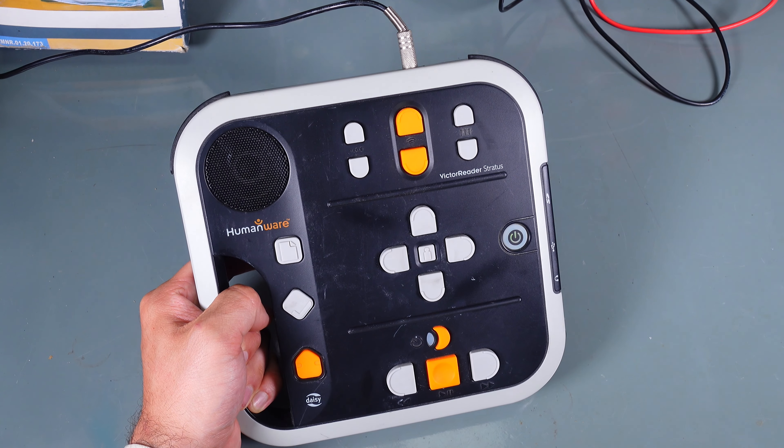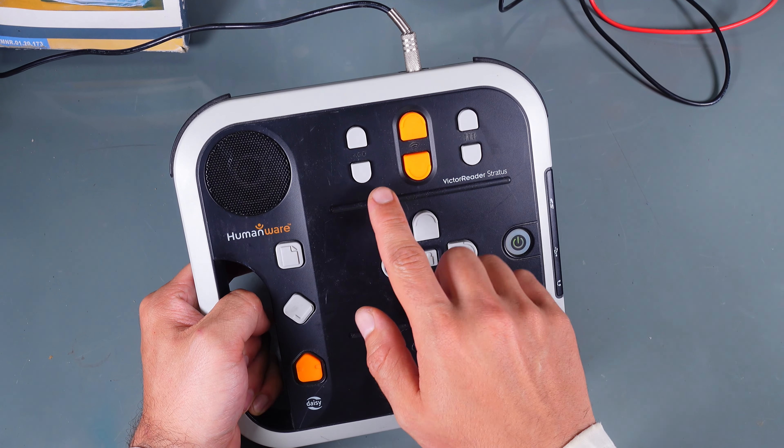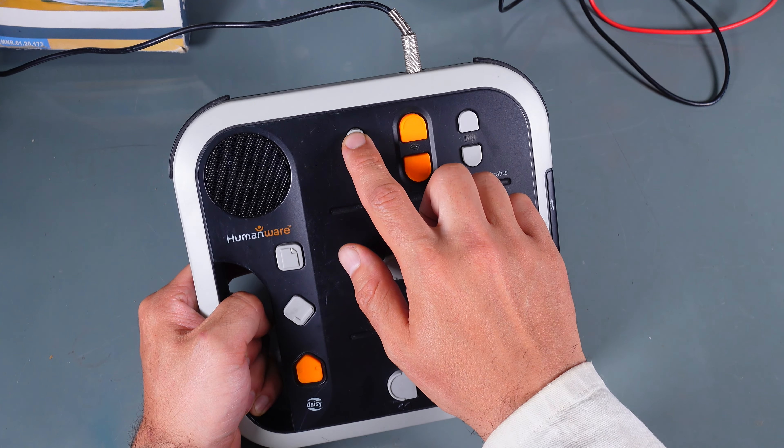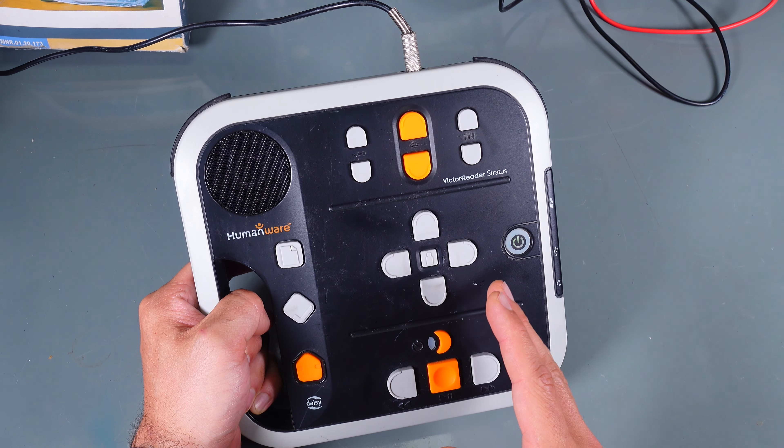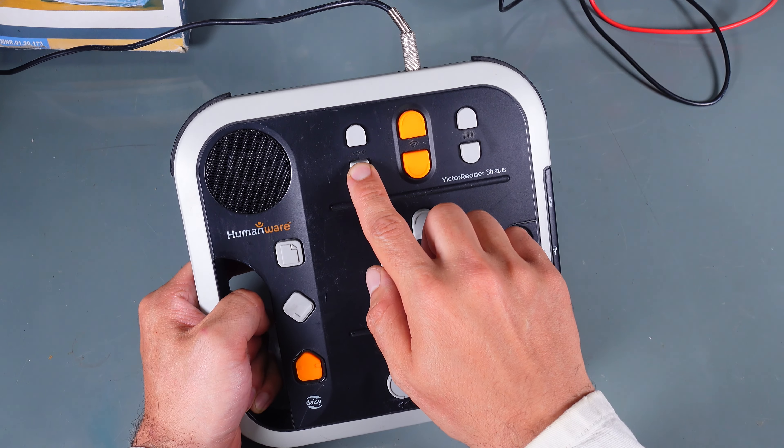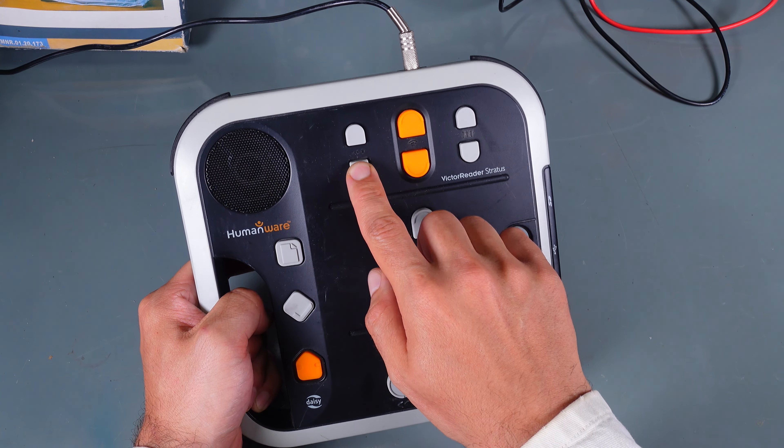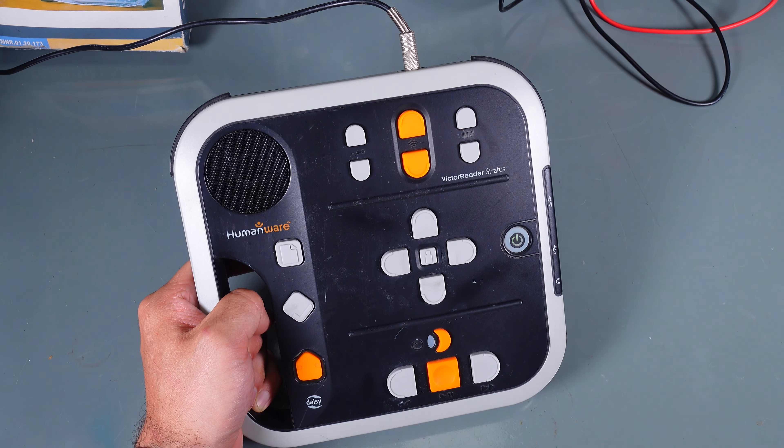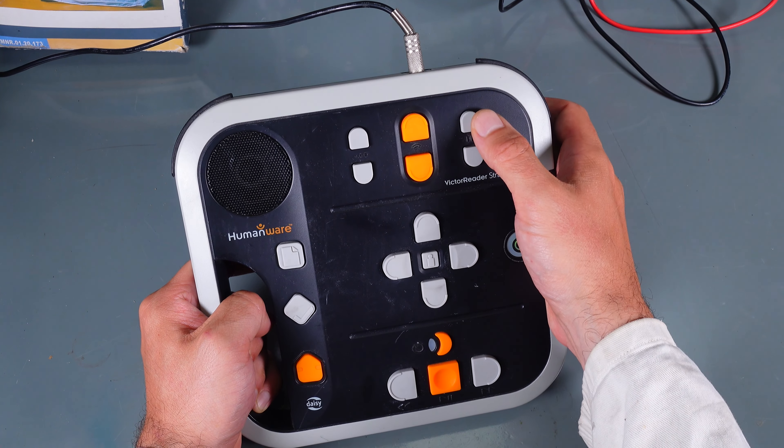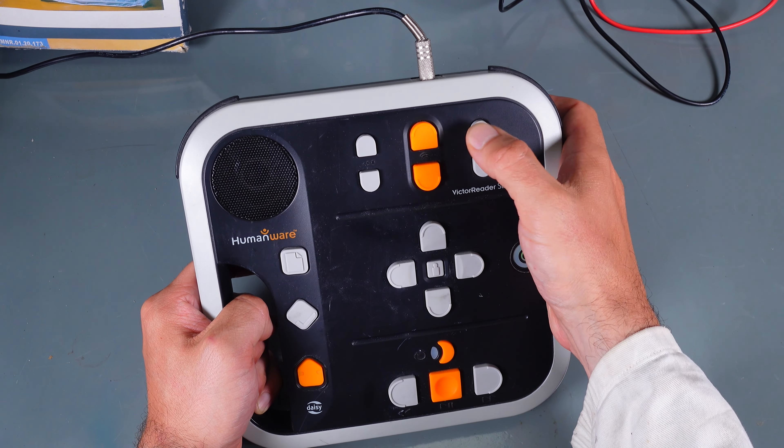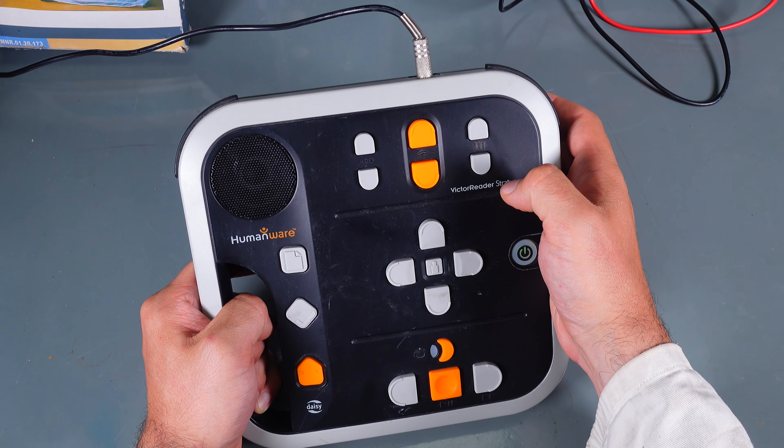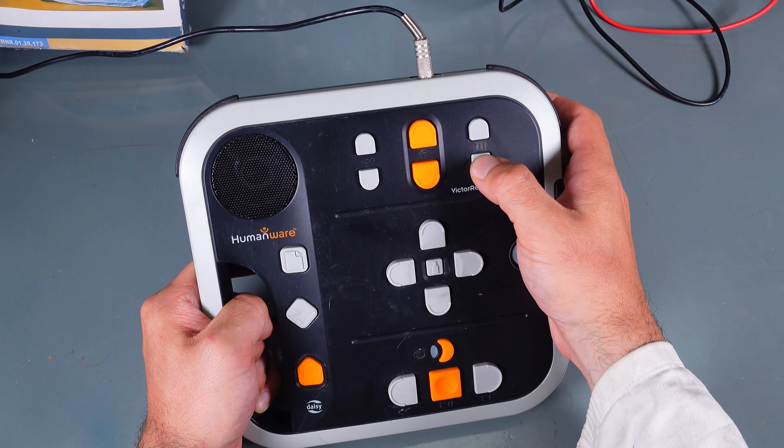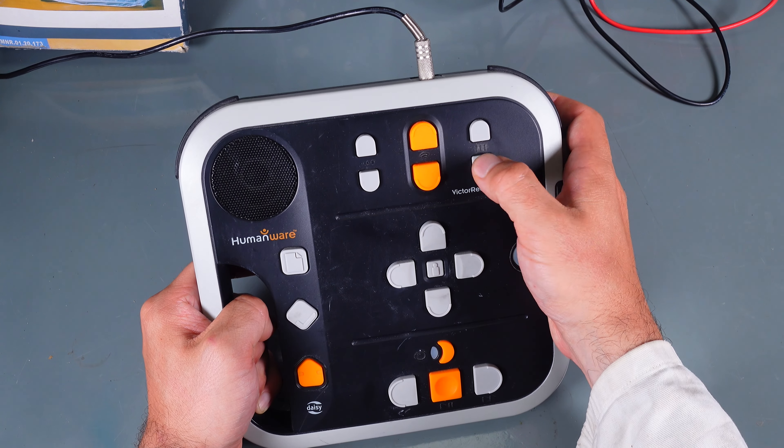I can lower it down a little bit, and here we can change the speed. By changing the pitch, you can see it's going faster, but I can make it slower so you can keep up. This adjusts the pause, but on audio it's not going to be working. The blank spaces are less long.